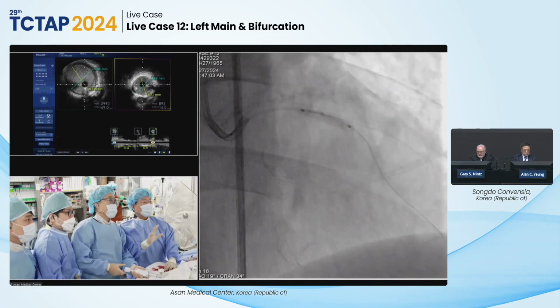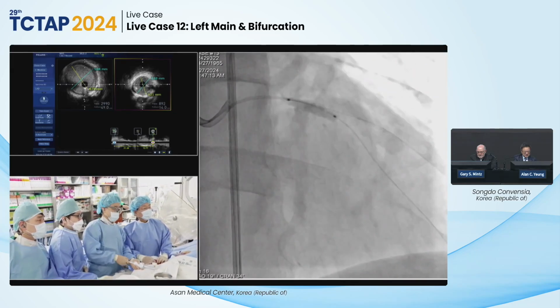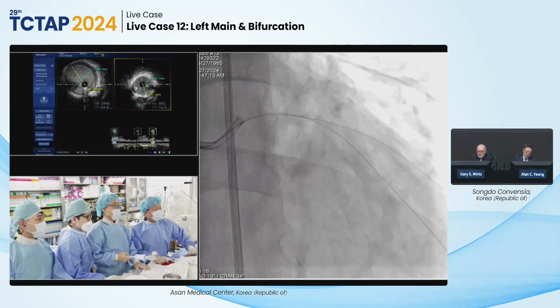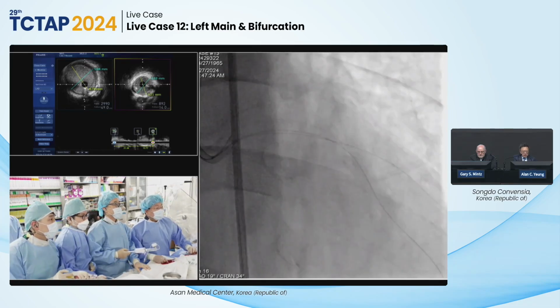All right, play. Split and 12, 14. 5 seconds. 1, 2, 3. Play, split. Yeah, perfect. The reason you want to wait a little bit, I think it's okay. Contrast, please. Faster. Hold on. Contrast, please.